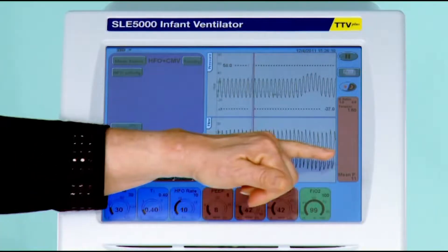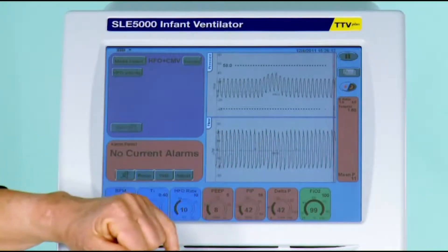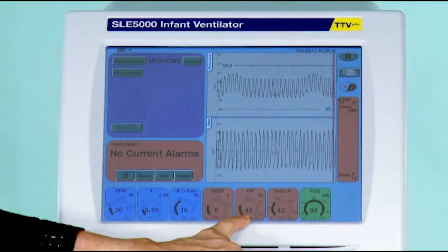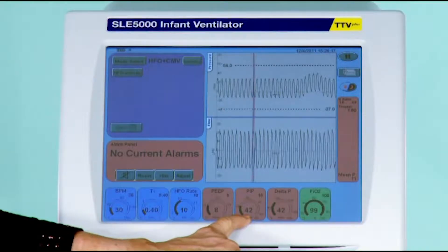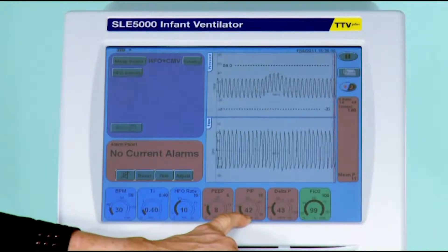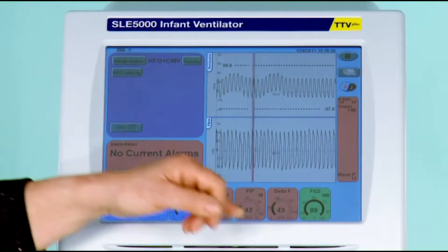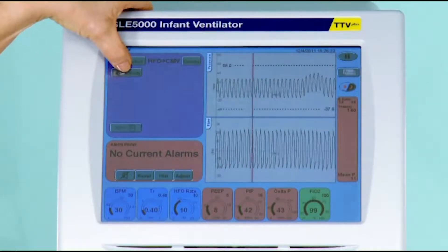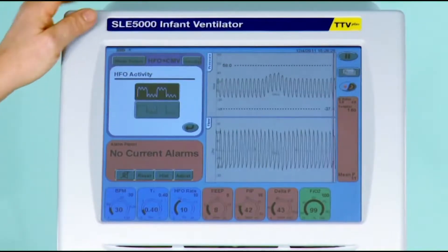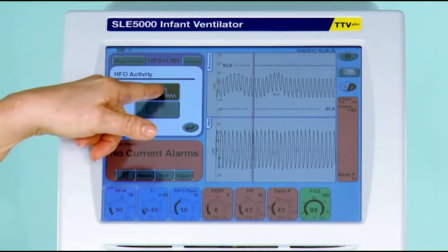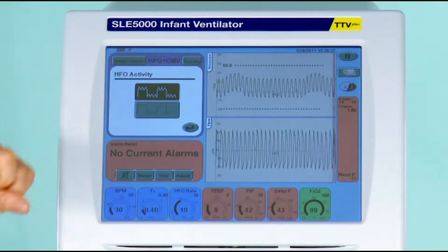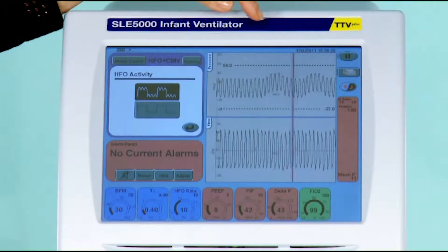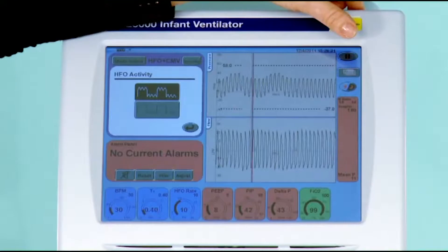This is because it takes half the Delta P and adds it to the peak inspired pressure. You also have an HFO activity button, and you can select it to be continuous, which means that it oscillates on both inspiration and expiration.